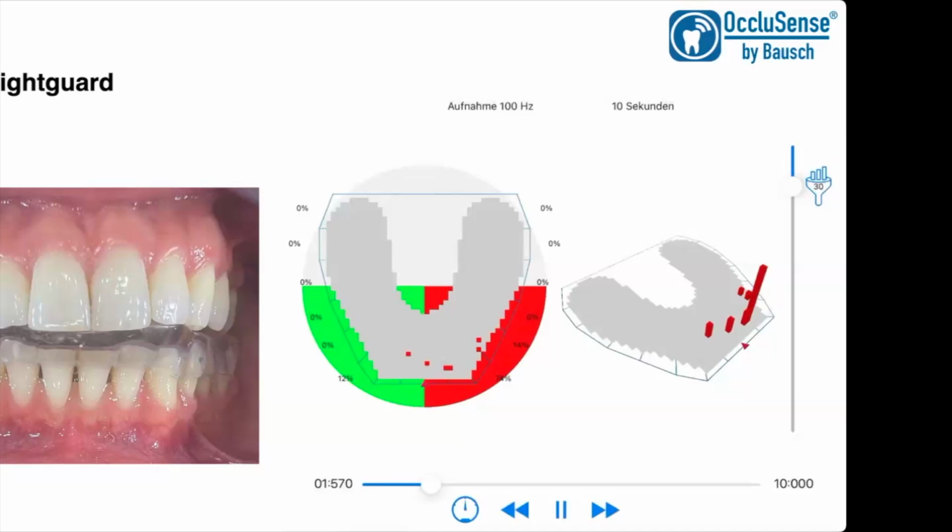So everywhere the millimeters are different. Yeah, I understand, this is the Michigan splint type. I know that, and I know this 4 millimeters. Normally in our curricula and our education, we raise the pin only by indication of the ceph. So we're measuring the lateral ceph and saying how many millimeters we have to raise, if we can raise. That's why I wanted to ask.